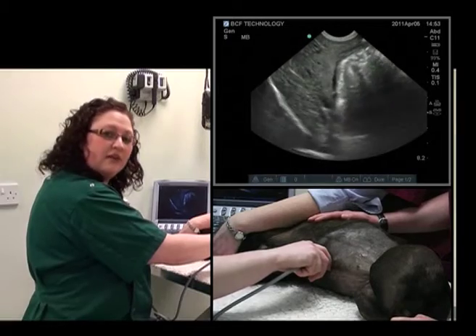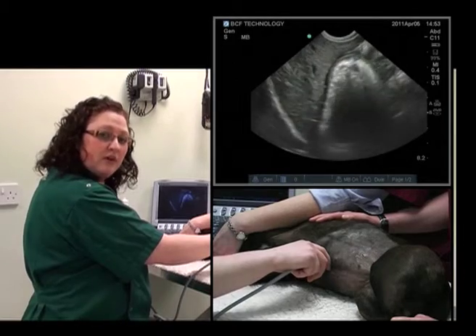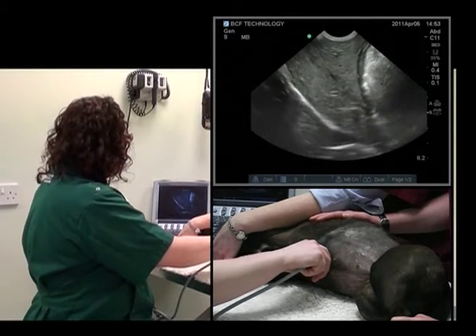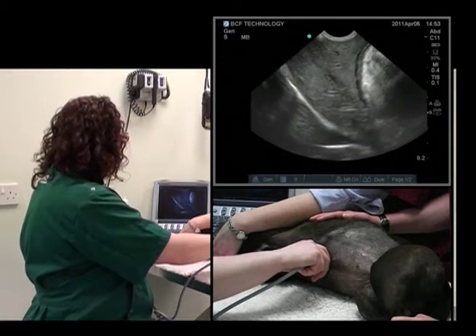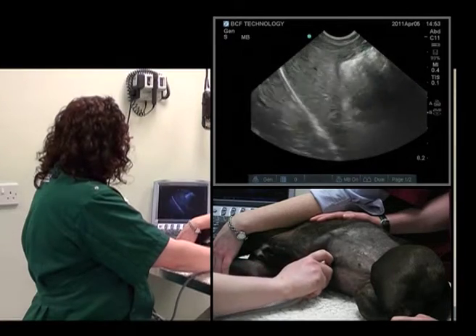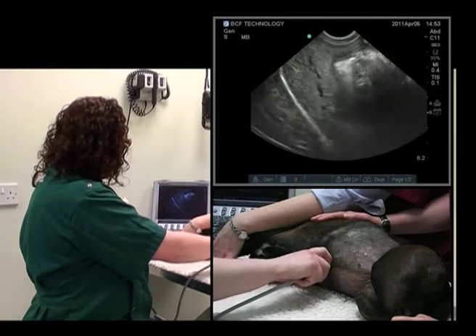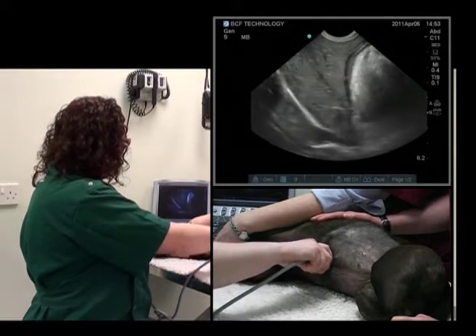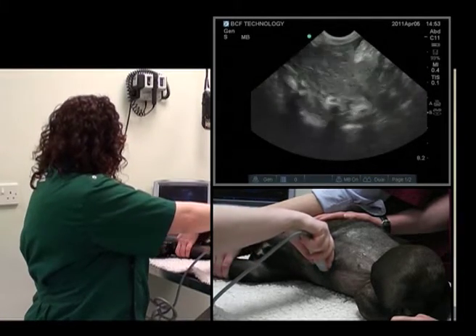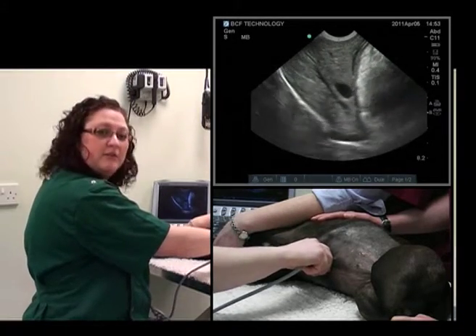We're in the midline in a sagittal plane with cranial to my left, which I know because my thumb is on the marker on the left side of the probe. We'll bring the liver into the center of the image, fan up until we lose it, then fan down — with the gallbladder coming into view — and all the way down. Then we come back to midline.